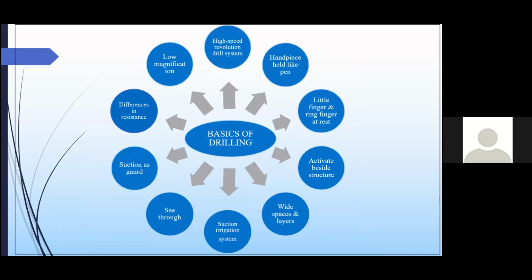So once we are ready with the drill system, the high speed drill and handpiece held in a proper position like a pen, one must also think about resting the little finger and the ring finger, because the more stable the hand is during the surgery, the fewer the tremors and the more efficient the work. And whenever we are starting the drilling, we should not activate the drill when it is not in our vision. We should activate it in the microscope, at the drill site, and as soon as we are done with the drilling part, we should deactivate the drill.